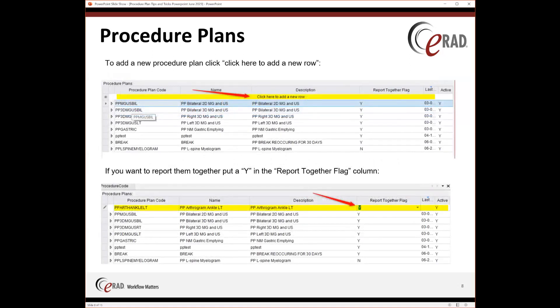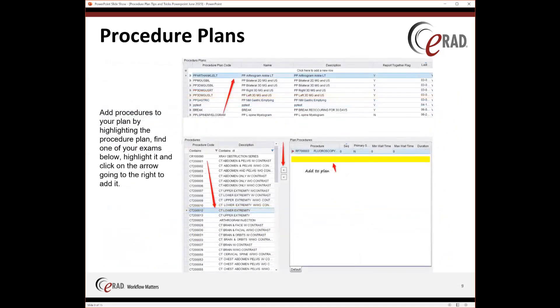To add a new procedure plan, you're going to click here to add a new row at the top of the procedure plan. Then you're going to put the Y in the 'Report Together' flag if you want to report them together. Then you're going to add your procedures to your plan by highlighting the procedure plan and then finding your exams below, using the arrow to the right to add them to the plan procedures.